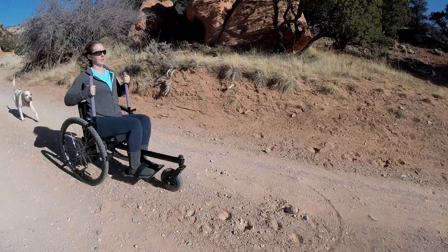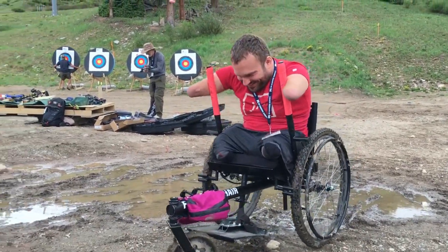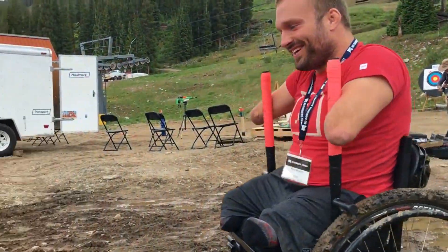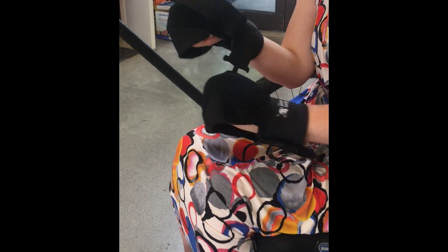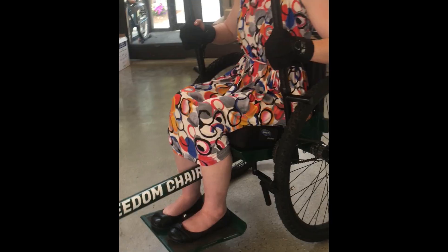Braking is similar — only you pull back on both to stop. This style of braking gives you a lot of control regarding speed and allows the Freedom Chair to be accessible to those who might have dexterity challenges. By utilizing a grip aid, such as Active Hands, those with limited dexterity can still safely drive and stop their Freedom Chair.